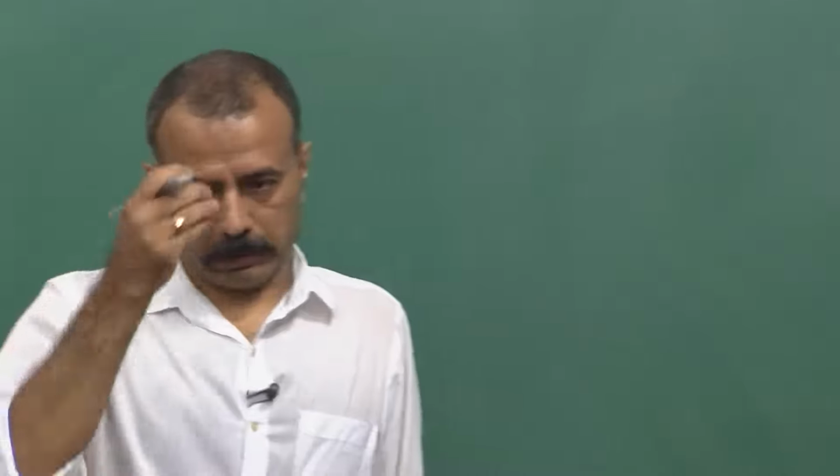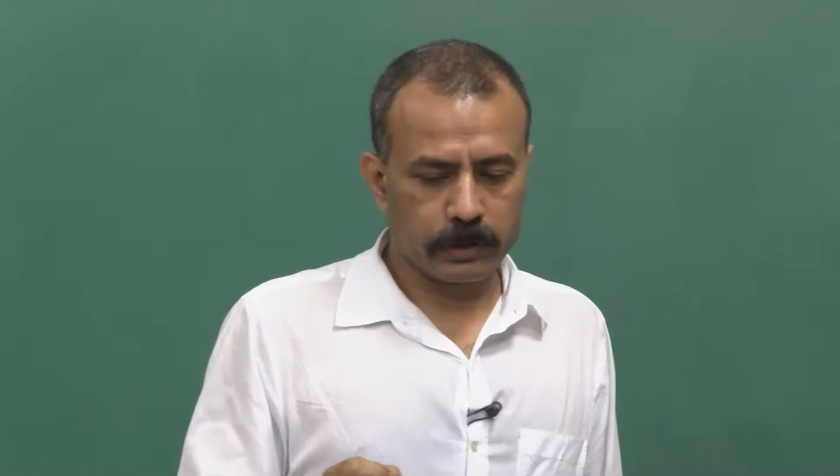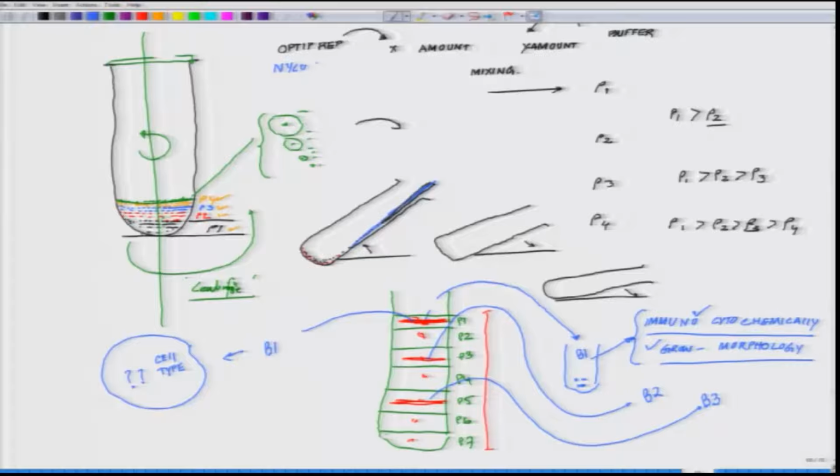Earlier, for embryonic neurons, for this particular technique, there was another such thing which is called Nycodenz. You won't find that anymore because they have discontinued this product. It is very similar to OptiPrep, Nycodenz, OptiPrep, sucrose.